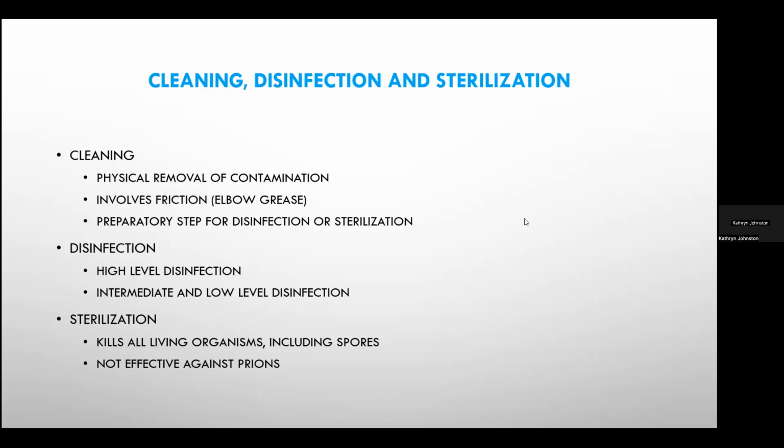High-level disinfection is indicated for semi-critical articles. Those are instruments or materials that come in contact with the mucous membrane of the respiratory, genital, and urinary tracts, and when skin is not intact. And although mucous membranes are usually resistant to infections by bacterial spores, they can present infection when they are contaminated with other microbial forms. So for this reason, they should be sterile, or at the very least submitted to high-level disinfection. This includes, for example, respiratory assistance devices, anesthesia, and endoscopic devices.